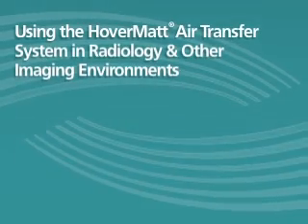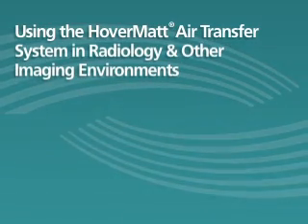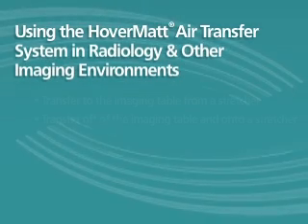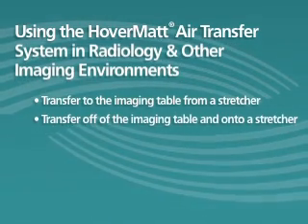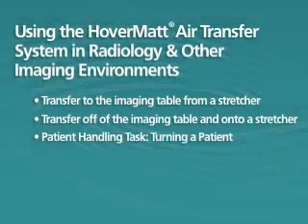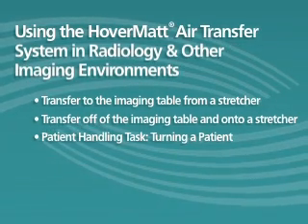In this section, we will train you on the proper use of the HoverMatt air transfer system in radiology. We'll show you the correct technique for transferring onto and off of an imaging table. We will also demonstrate another patient handling task, how to turn a patient using the HoverMatt.